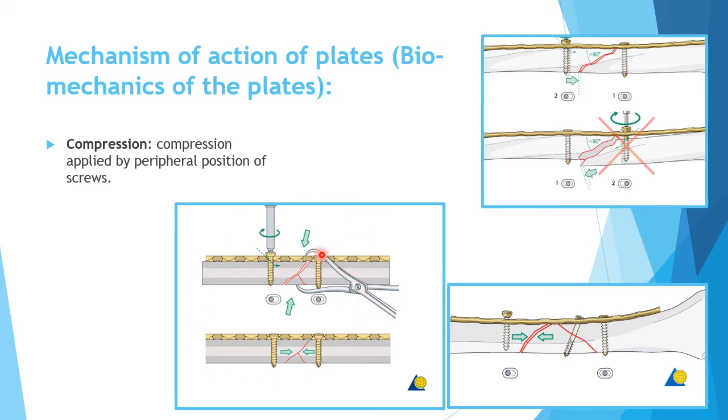This shows the same thing. So you will apply the screw first into the area that has the fracture segment more than 90, and then you will compress through the axilla. The difference here is that you have this butterfly segment. So you try to obtain a stable construct before compression so that you don't get shortening. The same here: you fix the screw and then use this lag screw to obtain a fracture segment that is more than 90, and then you will compress across that axilla with the fracture segment that is less than 90.